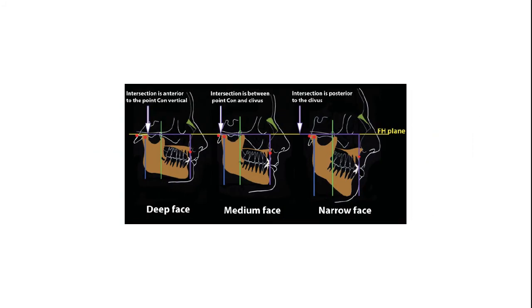The next is the facial height to horizontal facial depth ratio in cephalometric analysis. The orthodontist Hans Bimler introduced the suborbital facial index, relating suborbital facial height to horizontal lower facial depth in profile view using the lateral cephalometric radiograph. The horizontal reference line is the Frankfurt plane.